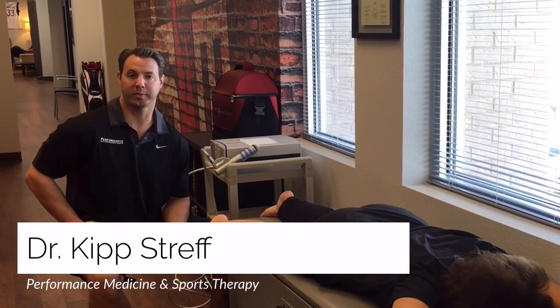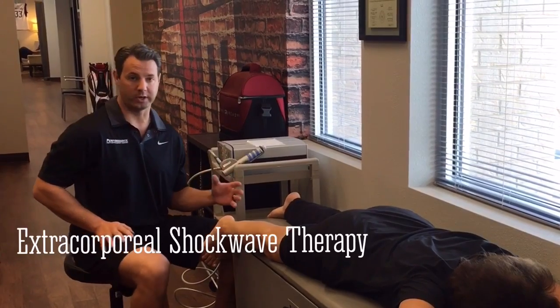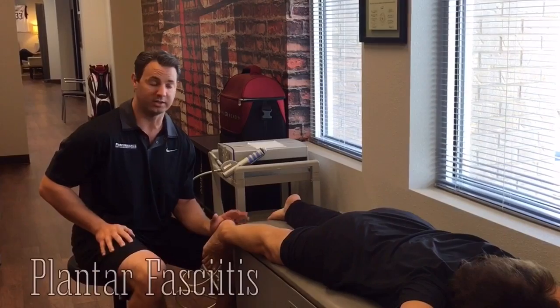Hey everybody, Dr. Kipp Streff here with Performance Medicine and Sports Therapy. Today we're going to talk about extracorporeal shockwave therapy, or the slang term is acoustic wave therapy, and plantar fasciitis and treatment for plantar fasciitis.